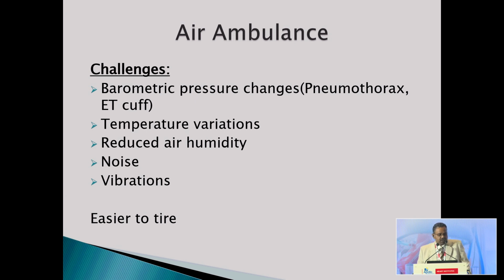That's what is expected. Also, there will be a significant temperature variation, especially in fixed wing aircraft, where it goes to a much higher state, where there may be hypothermia. So with the ECMO machine, sometimes it is better to carry the warmer also. If the weight doesn't permit, at least cover the tubings and other things with silver foil so that there will not be much heat loss till you get it to your center. And the reduced air humidity, noise, vibration, everything matters, and this can tire the entire team.